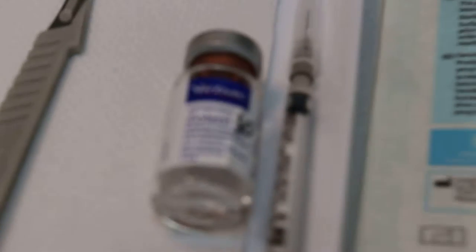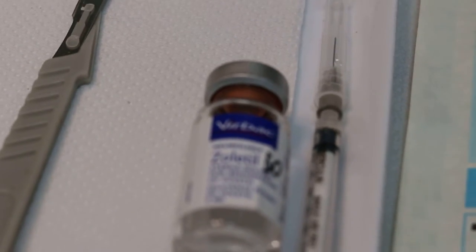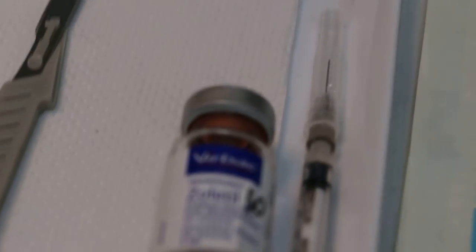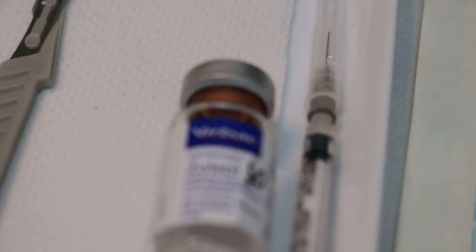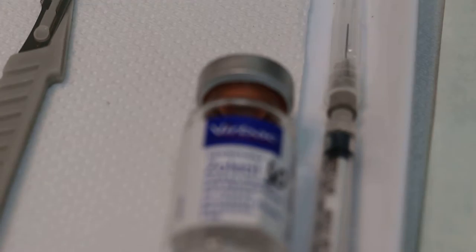Now Zoletil 50 will be used. Normally it's about 1 or 2 drops IM.